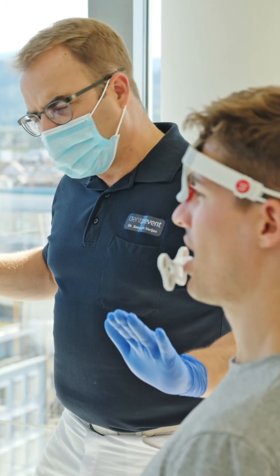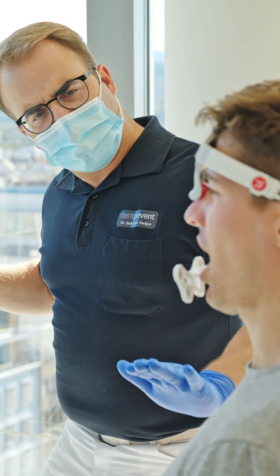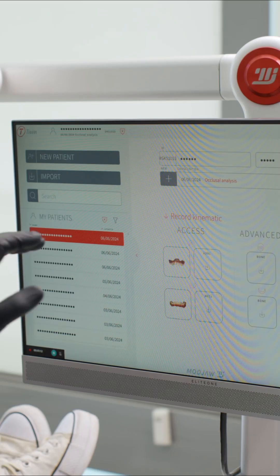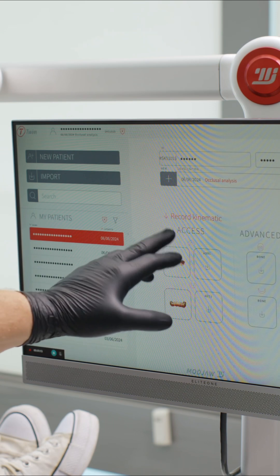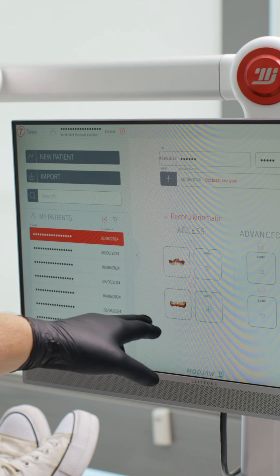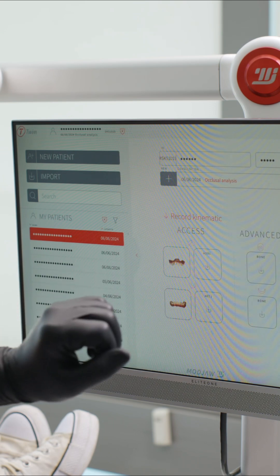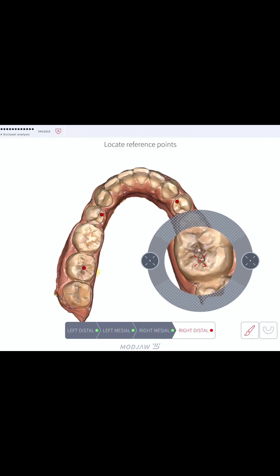Today, I'm excited to walk you through a jaw motion tracking procedure step by step. To start a new recording, upload the 3D models. Select the model of the upper jaw first, then upload the lower jaw.